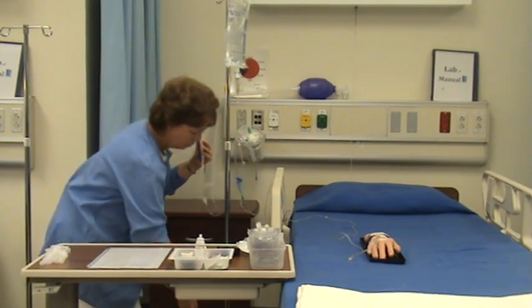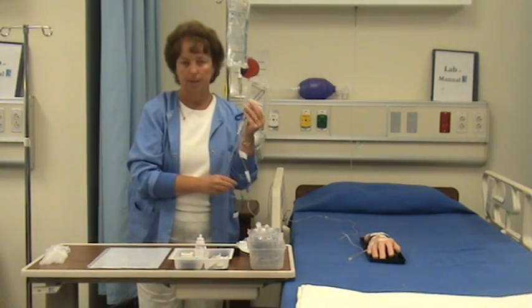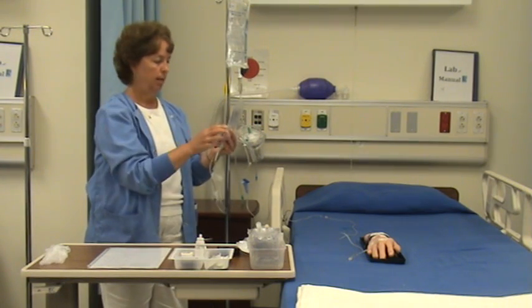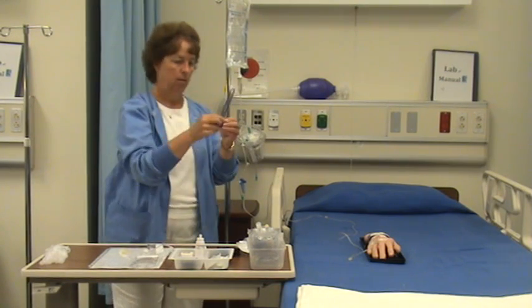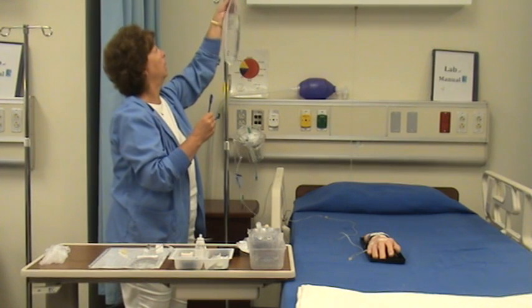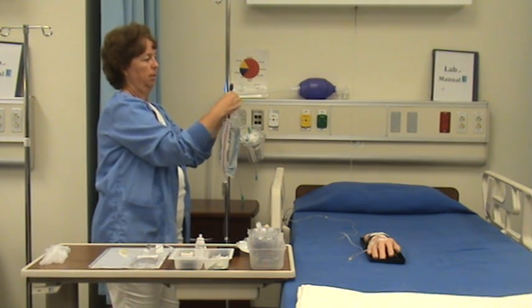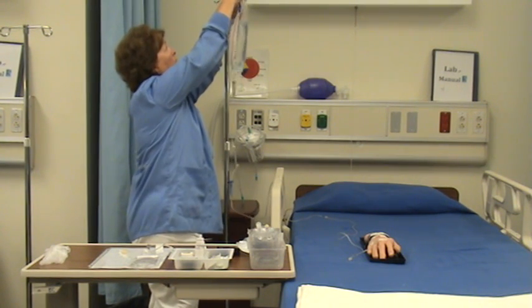Now the IV is running at 100 milliliters an hour, which is about 16 drops per minute. So it's already running. I'm just going to leave it running for right now. But what I'm going to do is take this hook and I'm going to take the primary IV bag, put that blue hook through there, and hang it lower.